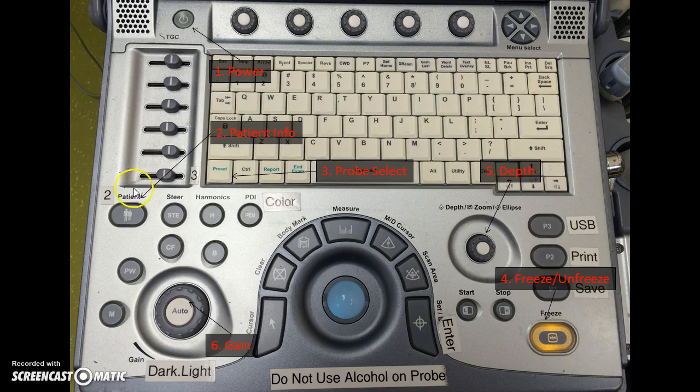And so the key things that I would point out here in terms of any user using their ultrasound machine would be one, where's the power button and how do I turn it off? Emphasizing that keeping the machine plugged in is the best bang for your buck, but certainly where's the power button is a really important concept when you're trying to figure out how to use the ultrasound machine.